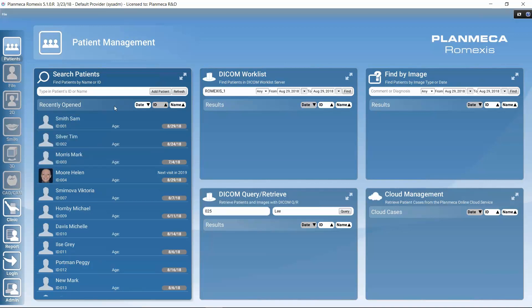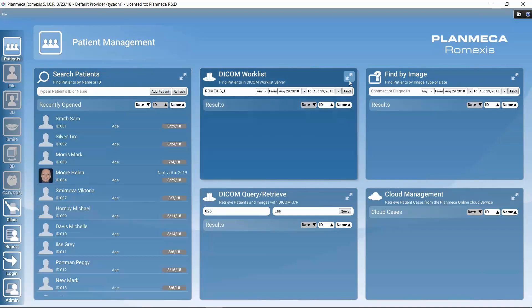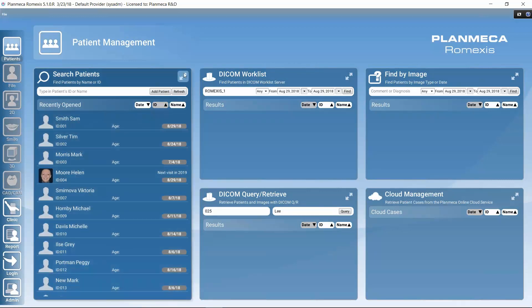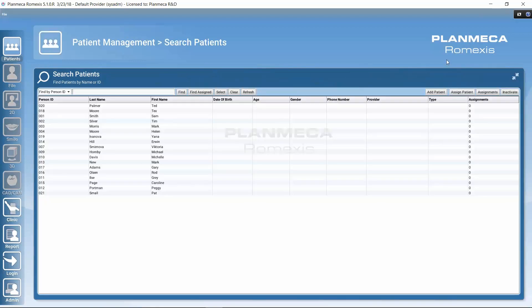All tiles in Romexis can be maximized using the double arrow button, providing more space for each function. In the maximized patient management view, we also have the option to assign patients to different Romexis users, in addition to the same functions available in the minimized view.